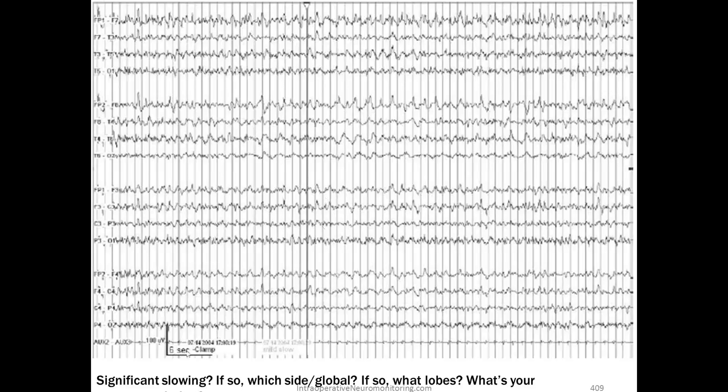Our display gain and all that looks reasonable. The bottom trace here is our EKG artifact. So we want to make sure we note that in case that's what they're looking for, and it replicates accordingly with that EKG artifact. If we look at our frontal versus temporal, we're making assessments here, and then the left side versus the right side. It looks a little bit slower here, for instance.